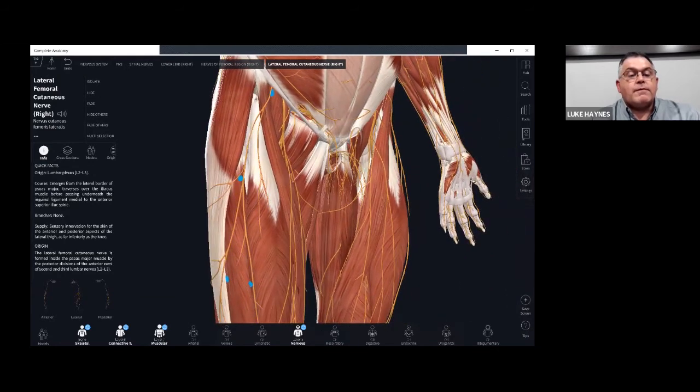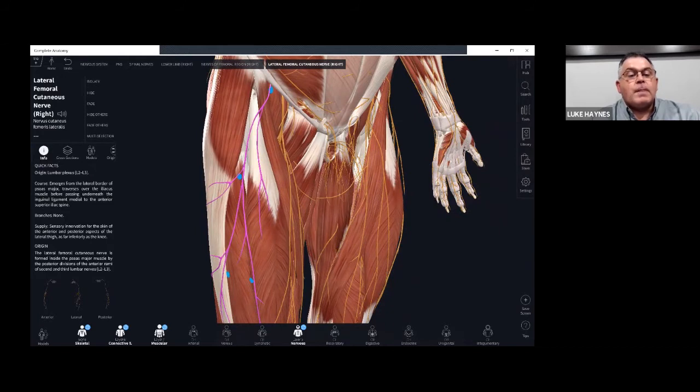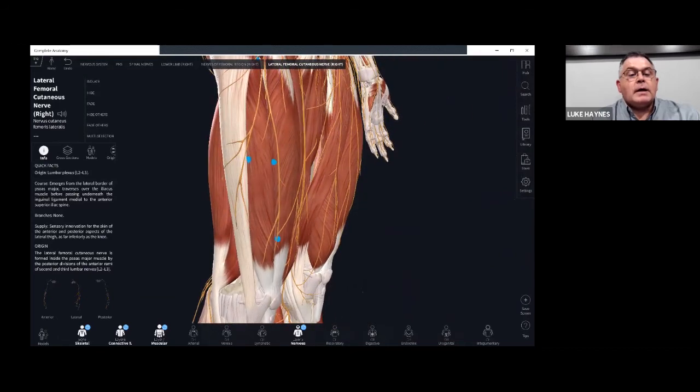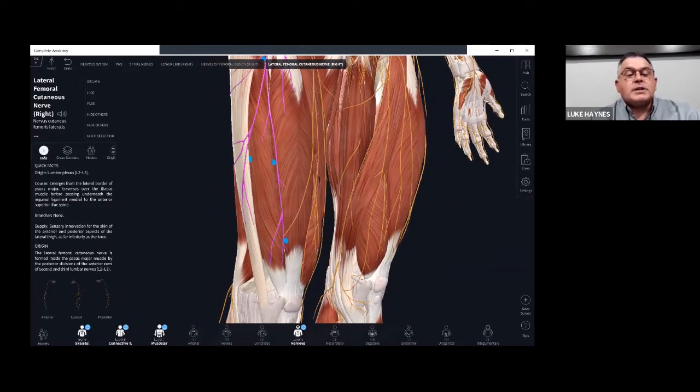We'll also come down further. Here we have TFL coming down, so the junction of vastus lateralis and rec fem, right in that area there. We'll come down mid thigh, anterior to the IT band, which is going to be our same location for vastus lateralis, so we can needle there. We'll also needle at the intersection of vastus lateralis and rectus femoris here.